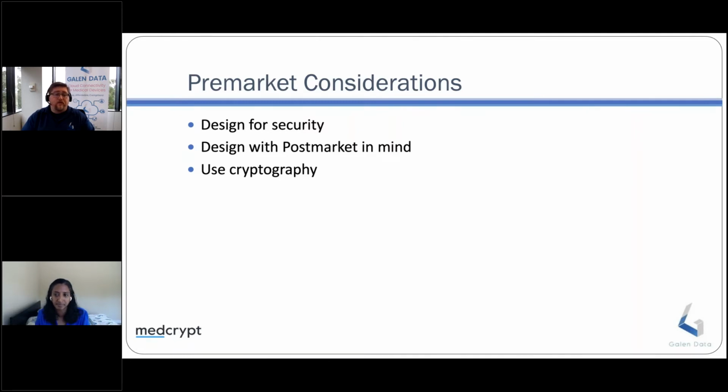Being able to deliver firmware updates has become a critical aspect of the FDA's focus as well, particularly with the SweynTooth vulnerability. That became very apparent to them: everybody needed a mechanism to update their devices, or at least a plan. If you're going to be mailing out USB keys to every customer, I guess that's acceptable, but that has its own security problems too.